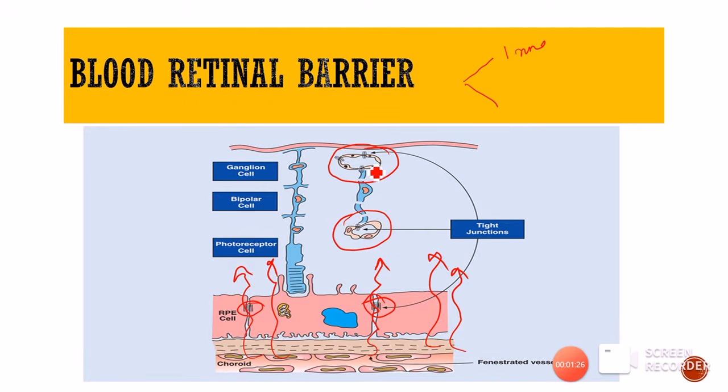Such vessels are going to allow the passage of the dye that we put in during fundus fluorescein angiography into the retina, and will help us in the dynamic evaluation of the retina and tell us about these pathologies. Therefore, the blood retinal barrier is very important, and specifically on FFA, if we find any disturbances, it should ring a bell that the blood retinal barrier might be compromised, either the outer blood retinal barrier or the inner blood retinal barrier.